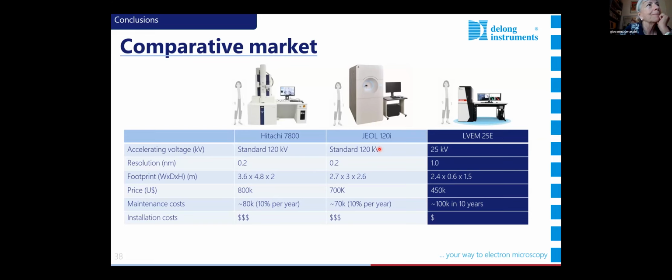Can you explain this? It's actually what we say is standard, but if you do 70 or 50, it will work even better, I would say. Our limitation will be around 120 nanometers. Above it will be hard for you. That is a sample from one of our collaborators, and he is doing 90 using uranyl-less. But we have many collaborations where we do 70 or 100. So it's really standard. If you do 70, it will work perfectly well. Okay, thank you.